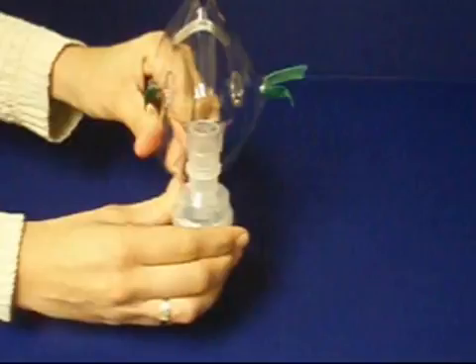Simply turn on your compressor. After a few moments, your compressor and nebulizer will be delivering a fine mist which you will inhale to get the medication deeply into your lungs.